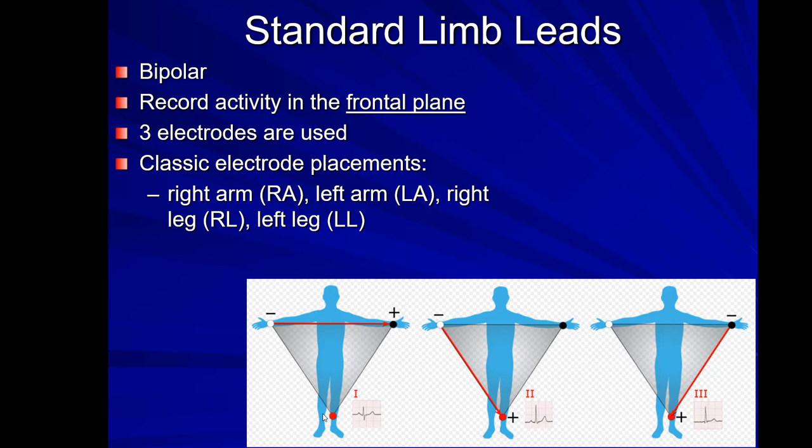The right leg, you're seeing nothing right here. I'll put another picture up. You're seeing nothing here. There technically would be an electrode here. It always serves as a ground. So everything runs off the left leg electrode.